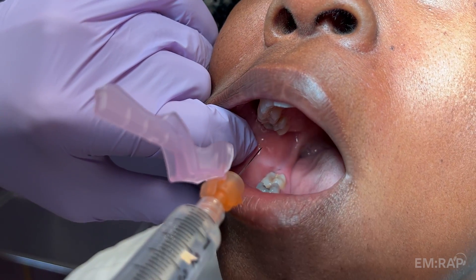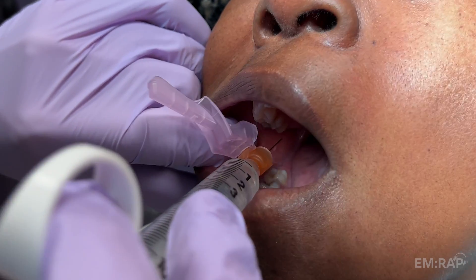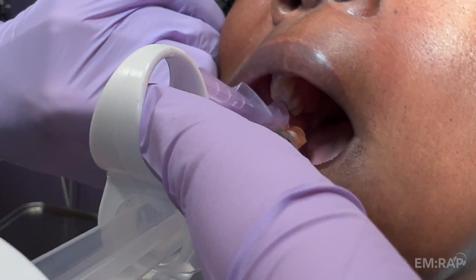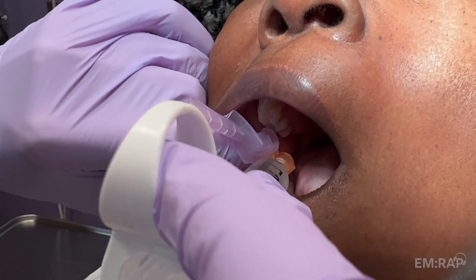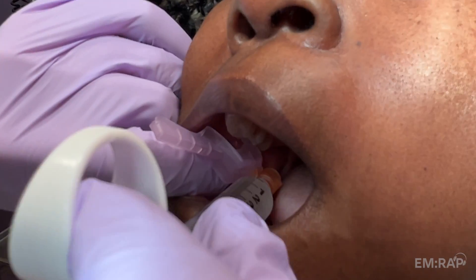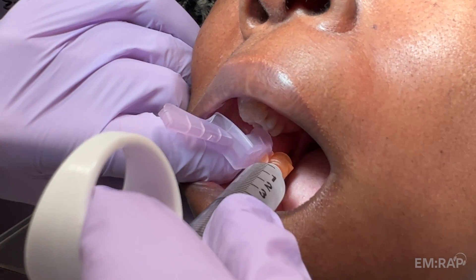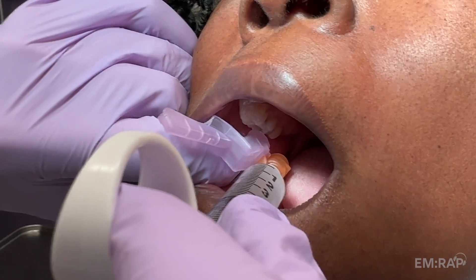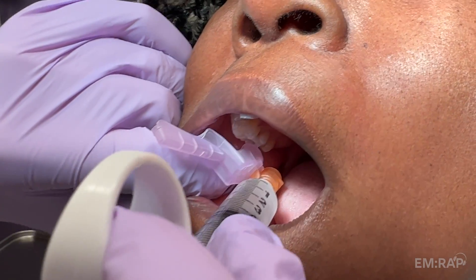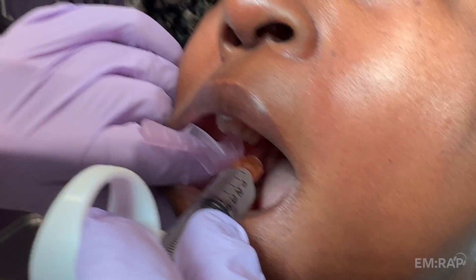Using a 25 to 27 gauge needle, aim towards the pterygomandibular triangle. The needle should be angled slightly laterally and inserted about 1 cm above the molar. In adults, the needle is parallel to the molars, and in children, the angle is a little inferior. You should touch bone with the needle tip to ensure the proper depth and angle.